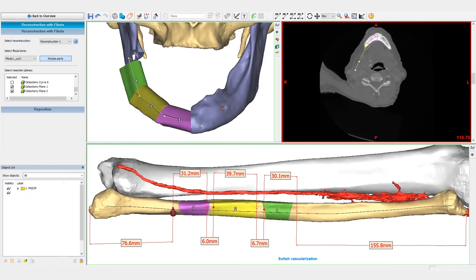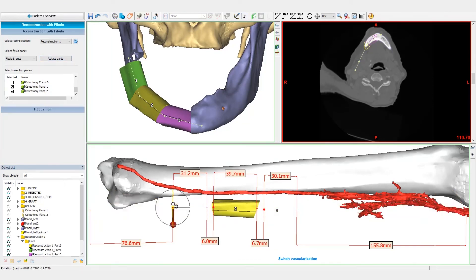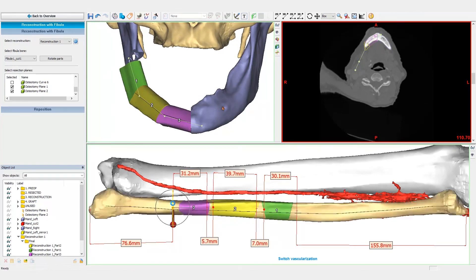Different approaches and surgical plans can be easily and quickly compared to each other. The vascularization can easily be switched from one side to the other by clicking the switch vascularization button.